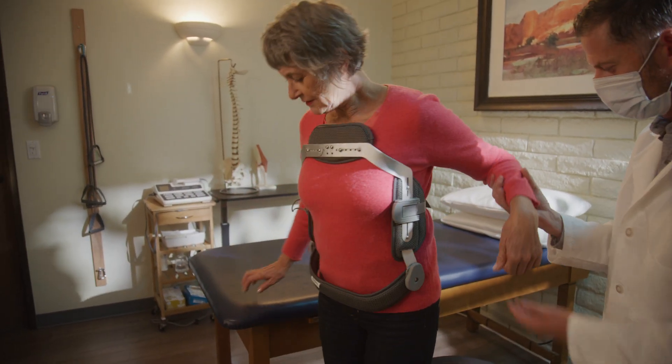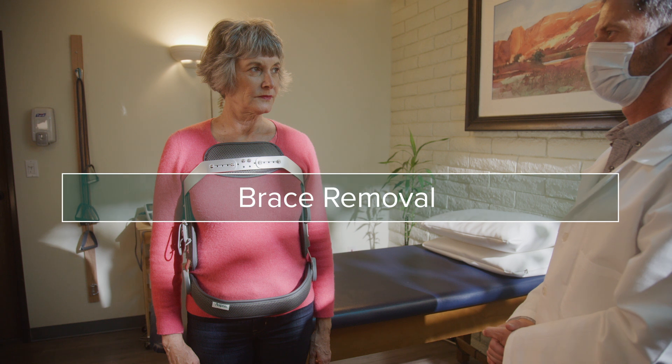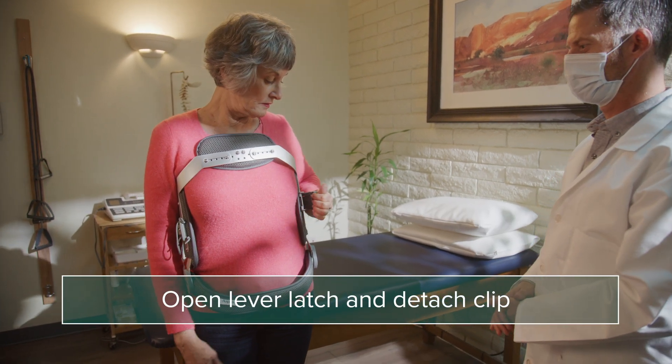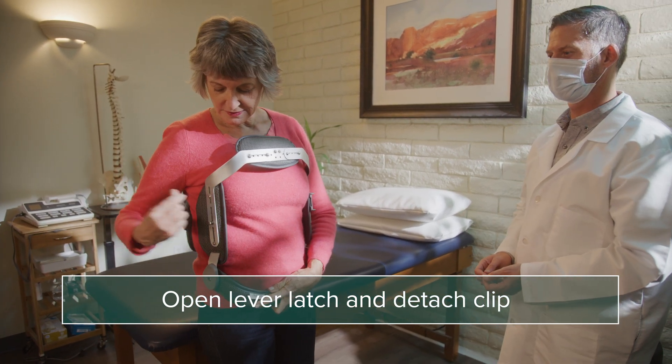Clinicians should always determine proper adjustments and wear time. Remove the brace by opening the lever latch and detaching the clip from the post.